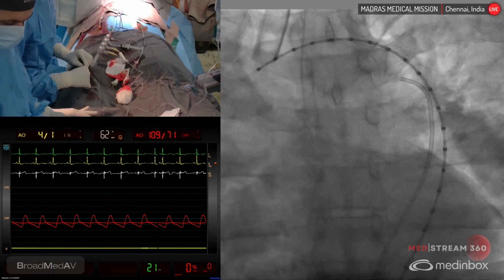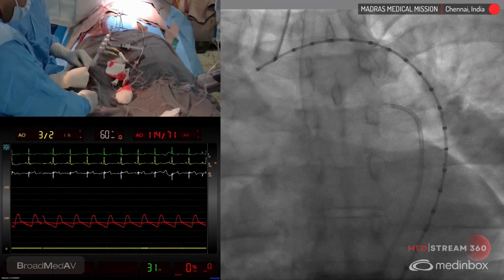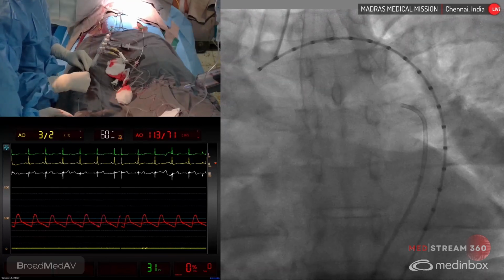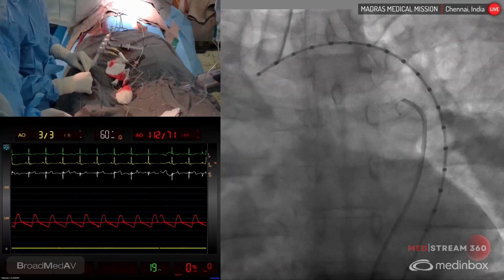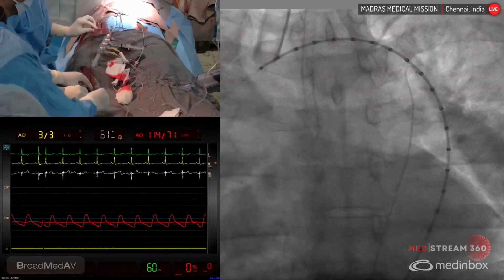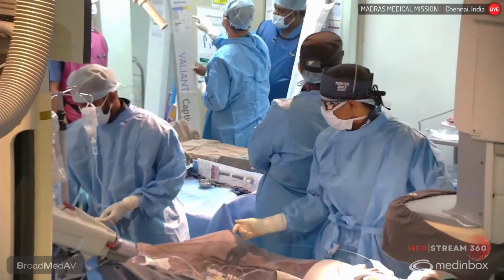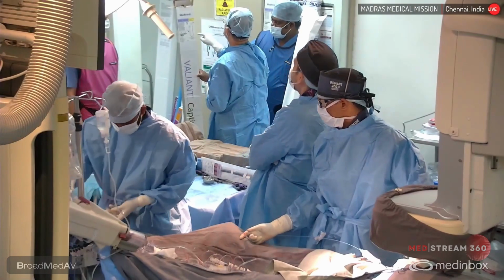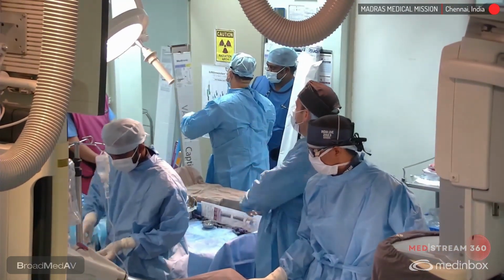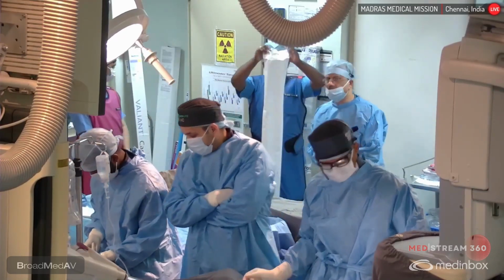This is the Amplatz super stiff wire, 0.035, exchange length 300 centimeter, right? 260, okay. One should never take the stiff guide wire directly. You should always take it over a catheter so that you don't traumatize the thrombus in the aneurysmal segment. So this is the Valiant Captiva device we are taking. It is 36 millimeter at the origin and 32 millimeter, so it's a tapered stent so that it adjusts to the size of the aorta, which is coming down in this case.